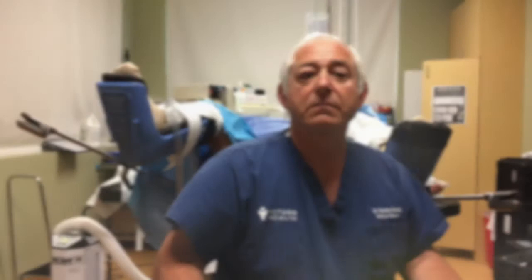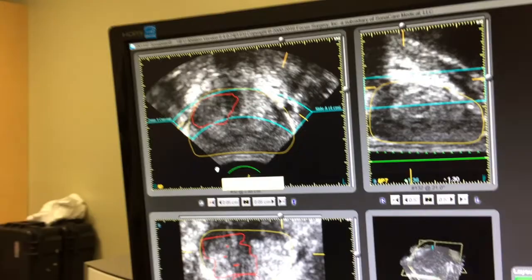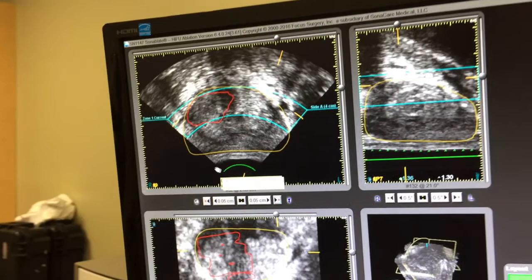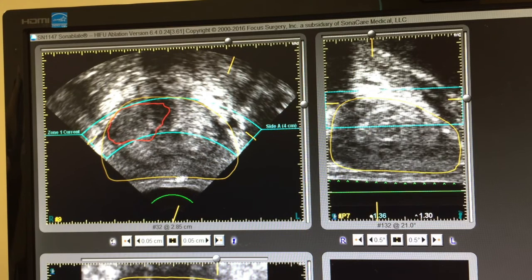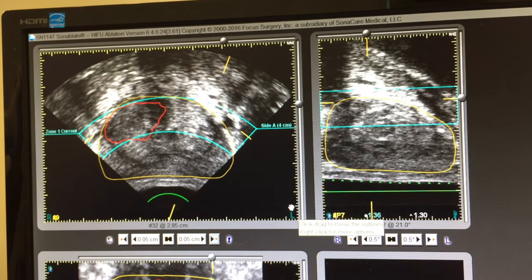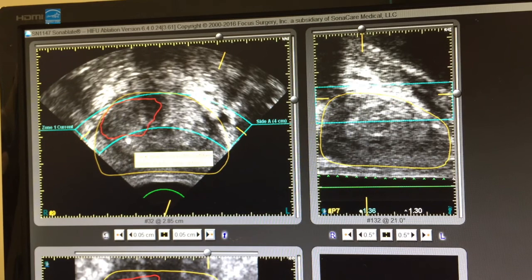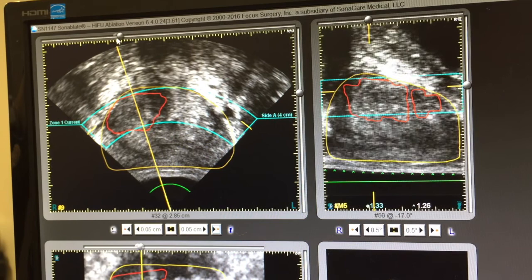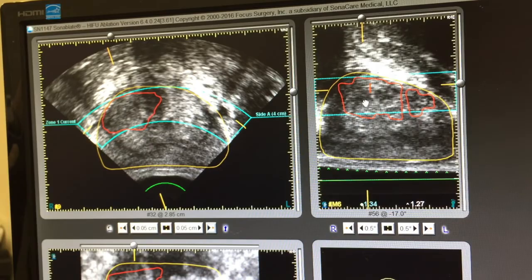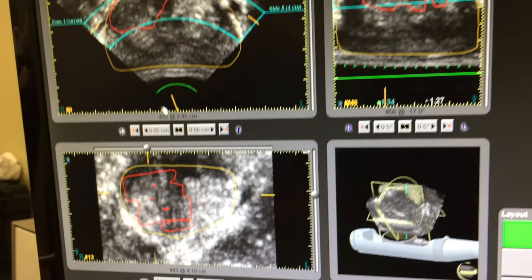We have now mapped the MRI to the ultrasound and we're in the treatment planning stage of this HIFU procedure. The yellow outline is the MRI outline of the prostate, and you can see how it follows beautifully the prostate outline on ultrasound — confirming a very precise fusion. The red area is the tumor as shown by MRI, now precisely mapped onto the ultrasound images. We can see this in multiple dimensions: the transverse dimension, the longitudinal dimension, and in the lower corner of the screen, the coronal dimension. I'll use all of these images to design the treatment and ensure we lay a very high dosage of energy over this tumor region.